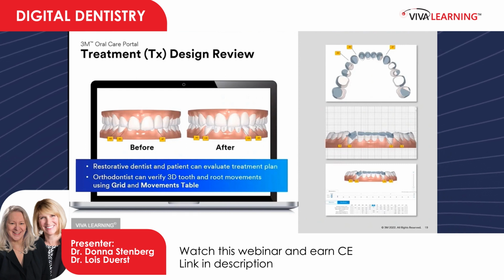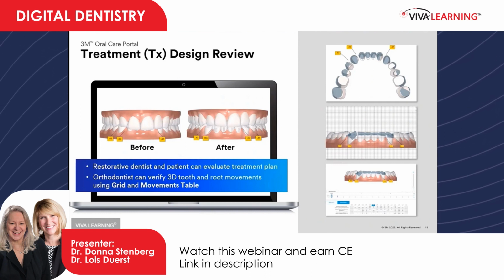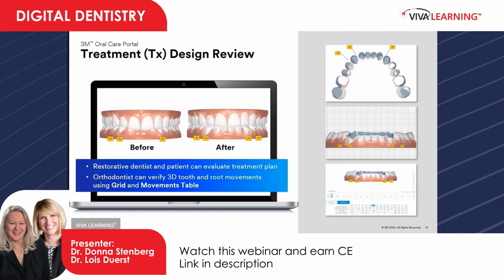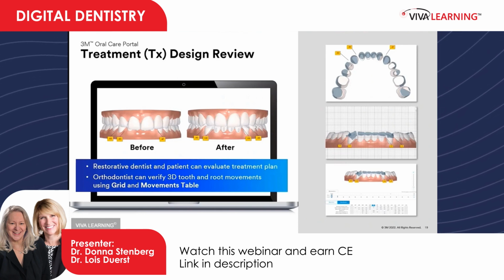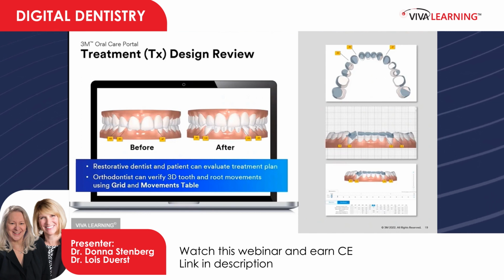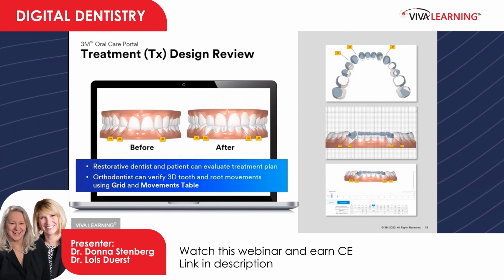There's a grid in the portal used for measuring changes from the malocclusion, and a movements table feature is really valuable for confirming changes in the tip and the torque in all three dimensions. If I had a vertically sensitive case, for instance, I can check the movements table to confirm that no extrusion has been applied to the posterior occlusion. Sometimes these small movements are harder to visualize, and having the numbers supports my decisions.